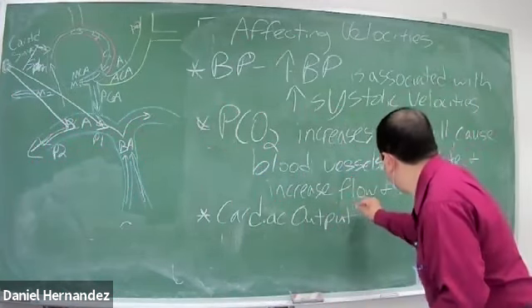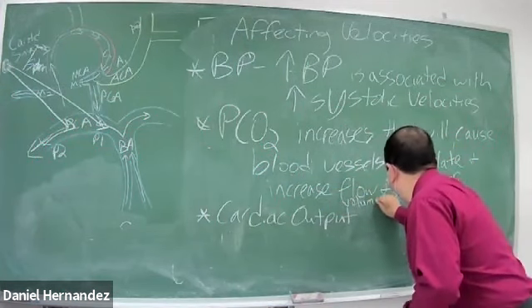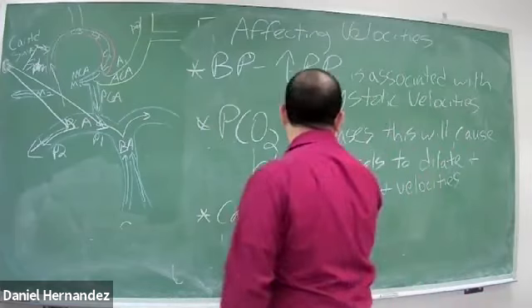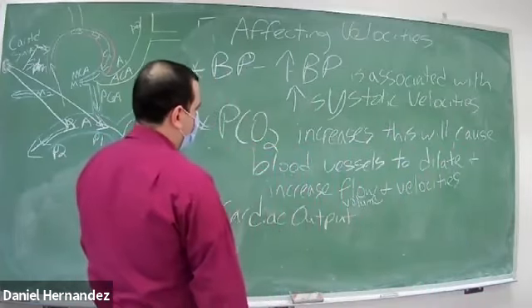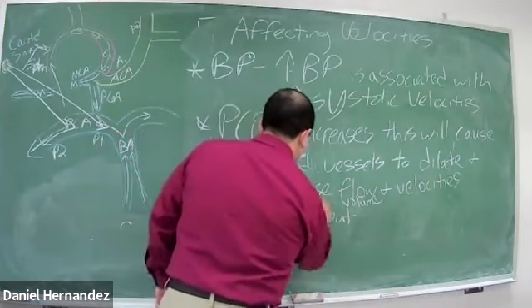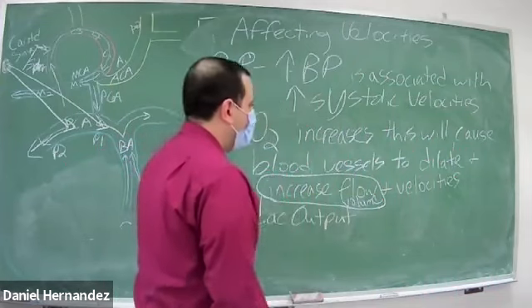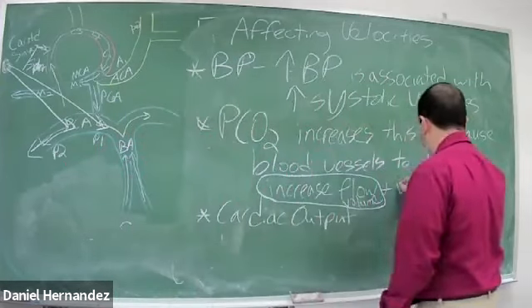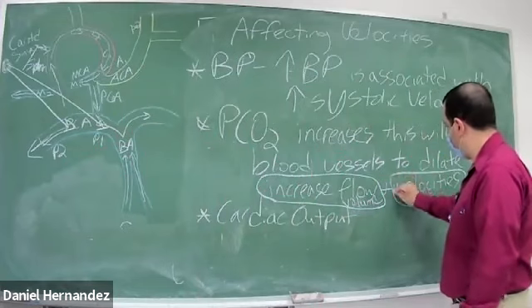So I'll put increased flow volume. That's the big part of that. That increased flow volume will lead to increased velocities.